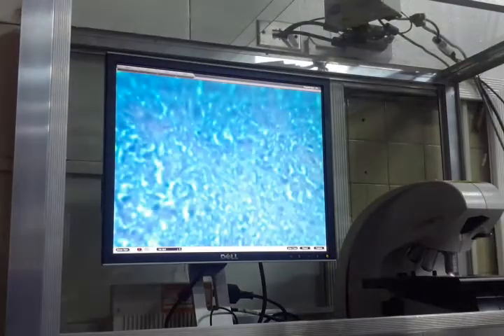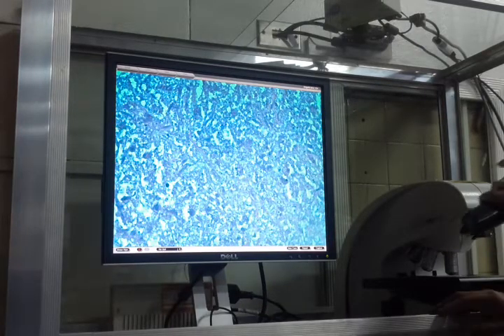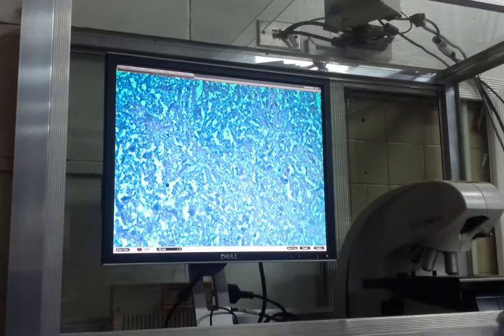Oh, do you recognize that as a tissue? What do you see? What color? Is there a nucleus? None. Not even a neutrophil or a lymphocyte.